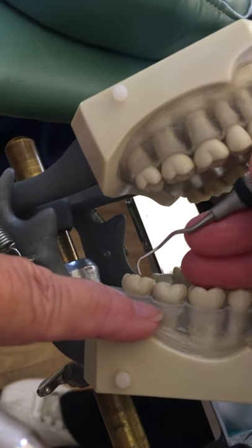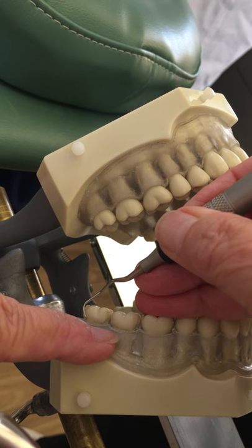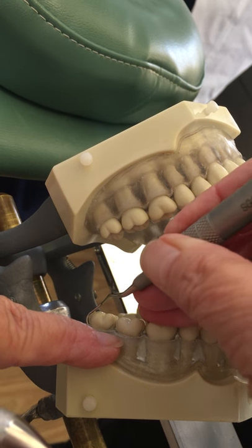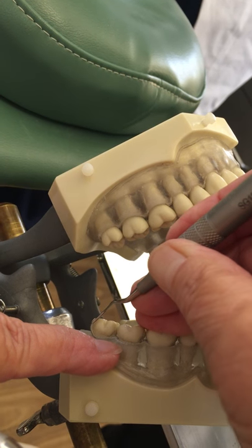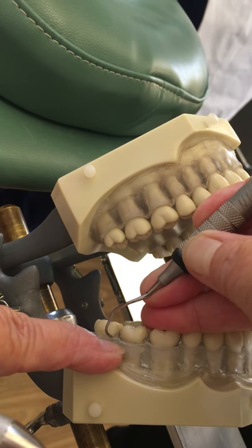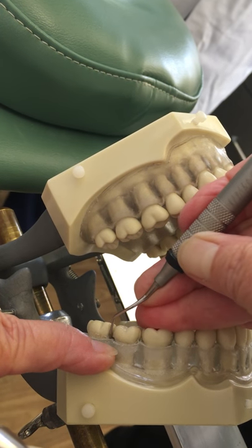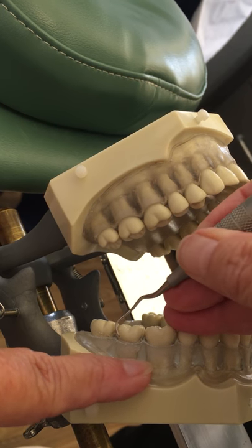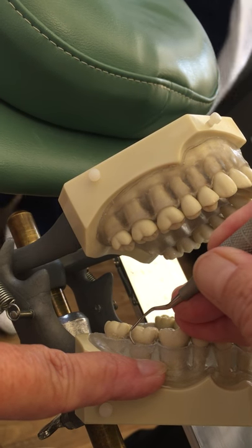I'm going to start again with my fulcrum on tooth number 30. I'm going to turn my toe in the mesial direction. I'm going to pull in close to the tooth — closed — which is closing it. I'm going to explore, insert, and then open slightly by pulling my shank away from the tooth and keeping just the terminal third of the toe on the tooth. When I get done, I'll move to the next tooth, adjust my grasp, go enclosed, and then open.